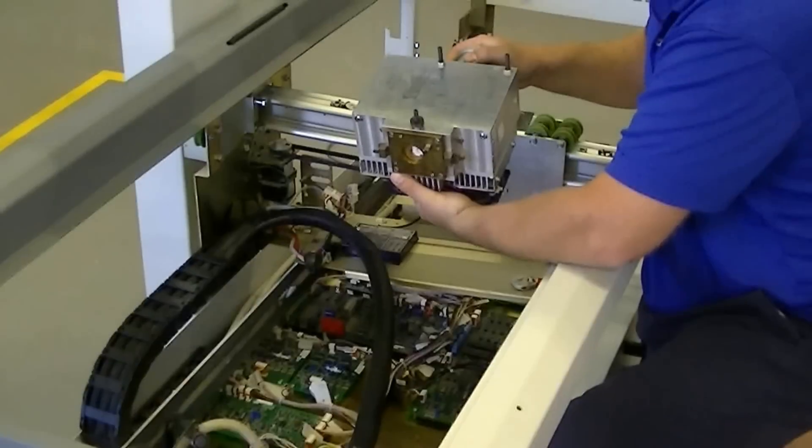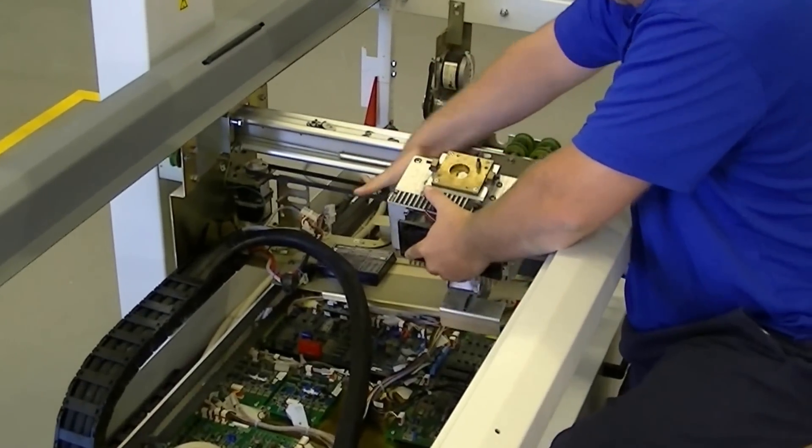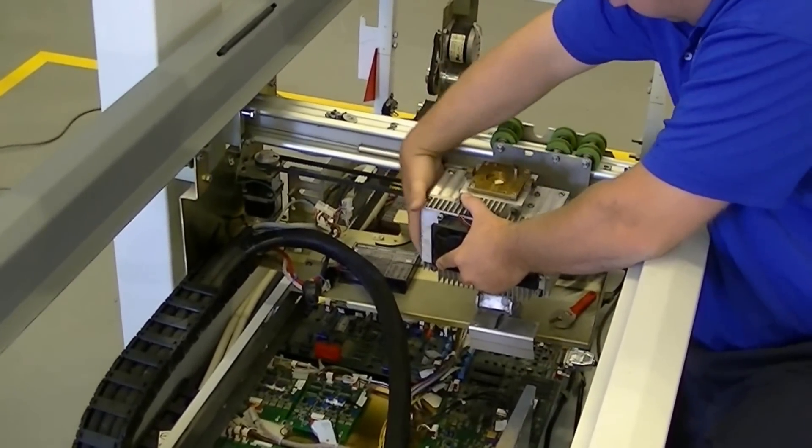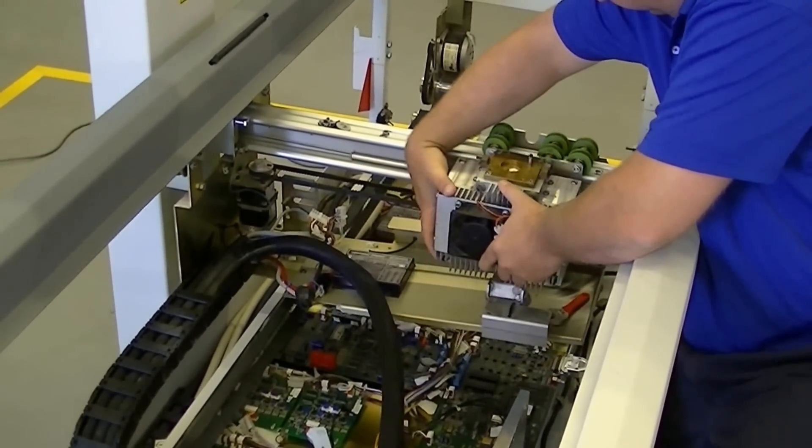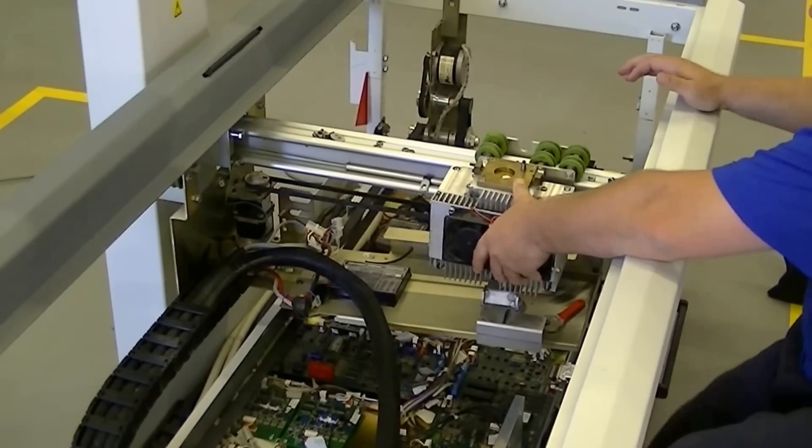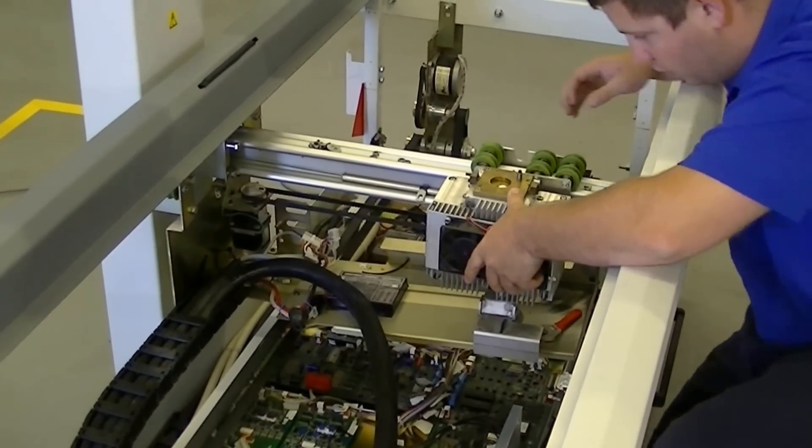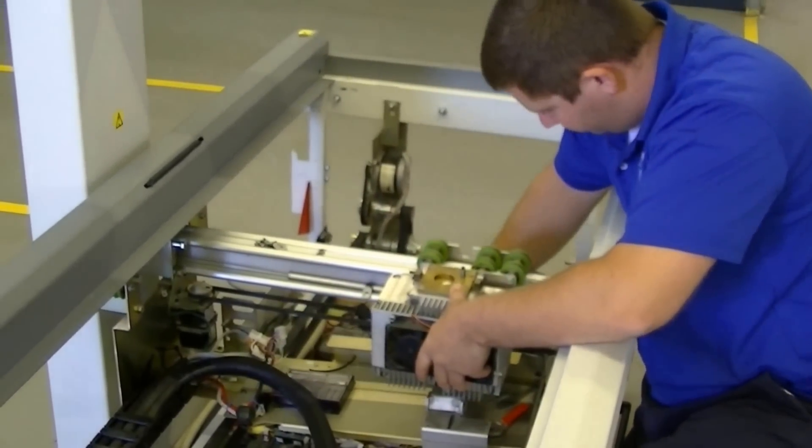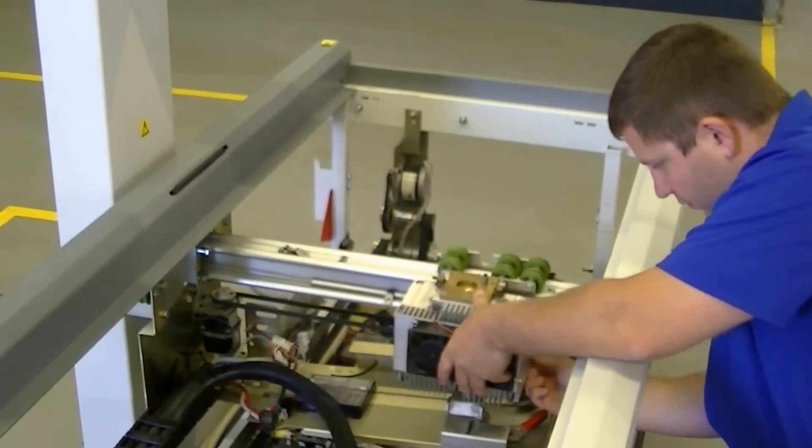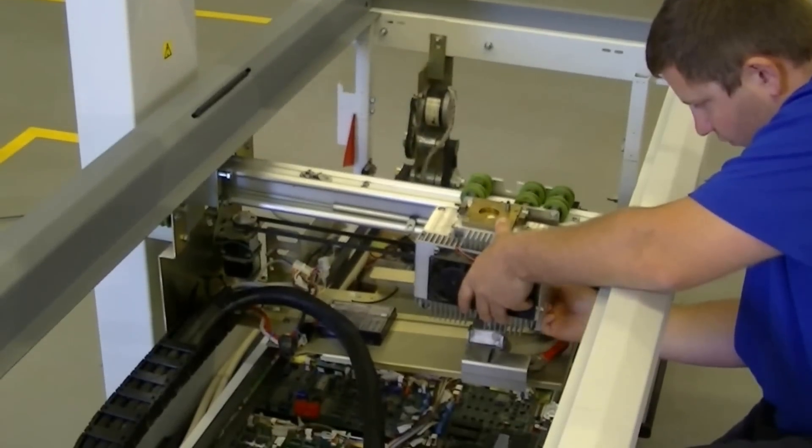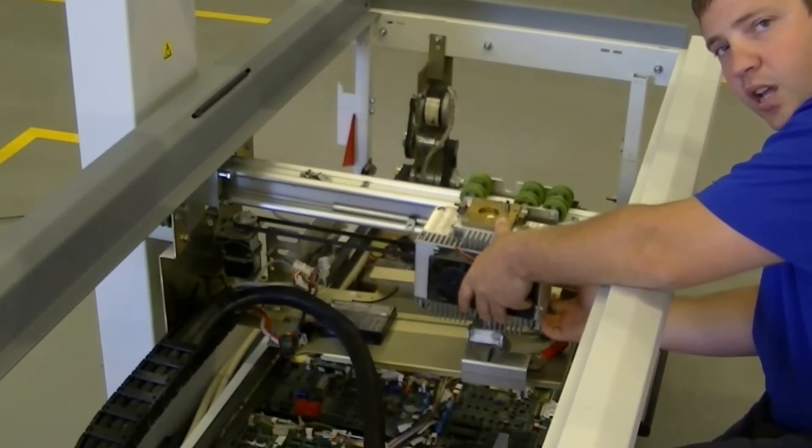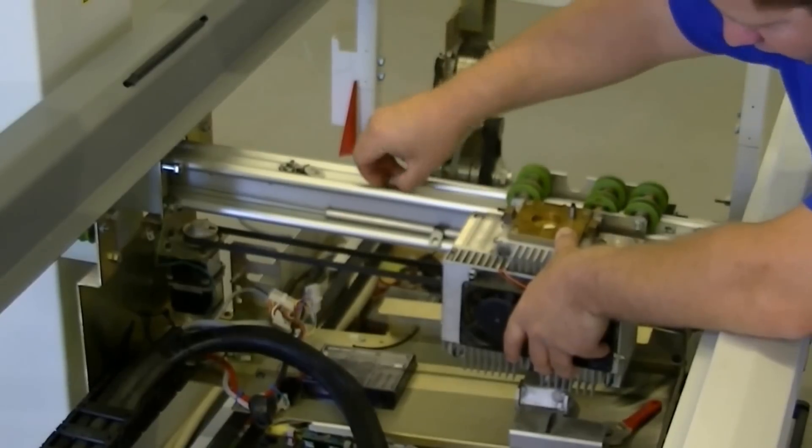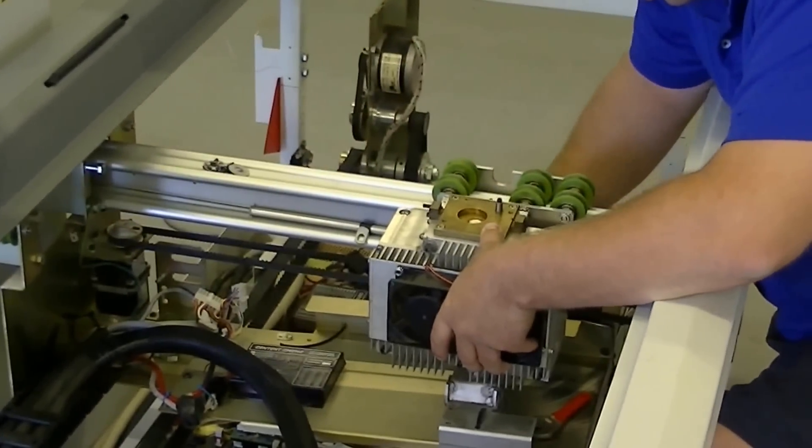Then we'll align the three bolts into the holes. Once you have it secured in here, you will want to put the two bottom nuts on it. You don't want to tighten them up at first, you just want to hand tighten them. Then we will move it around to align.